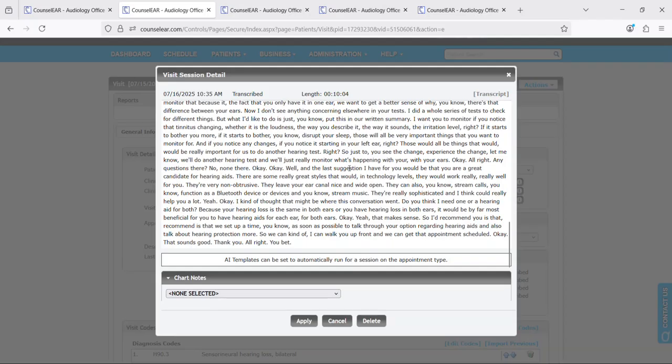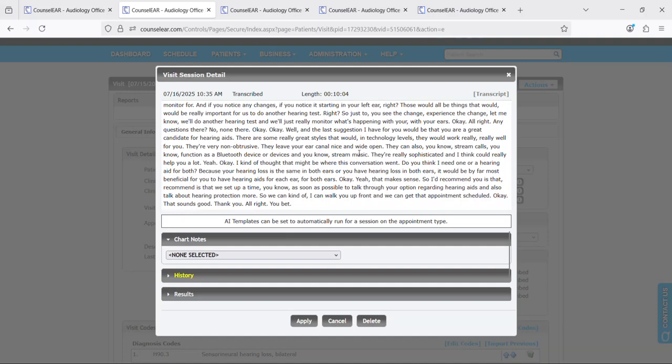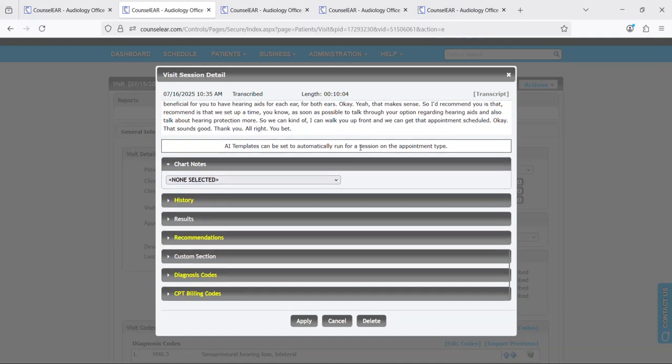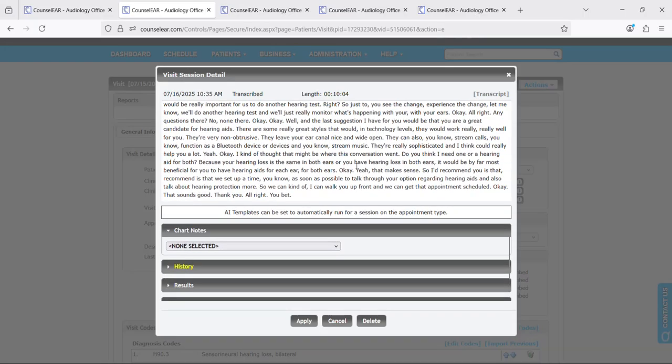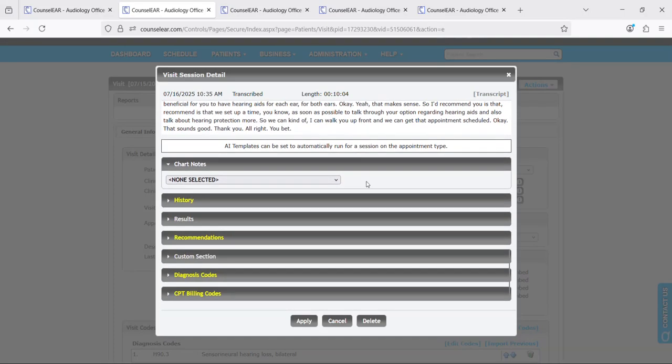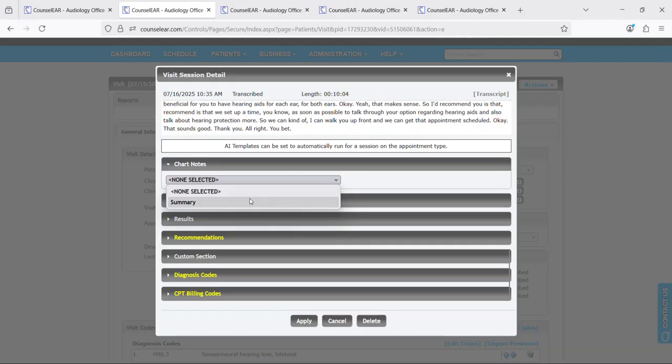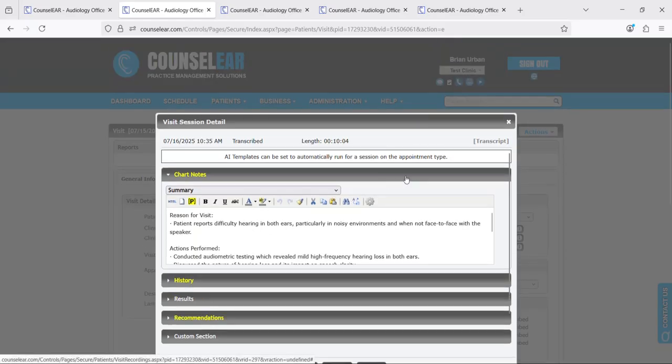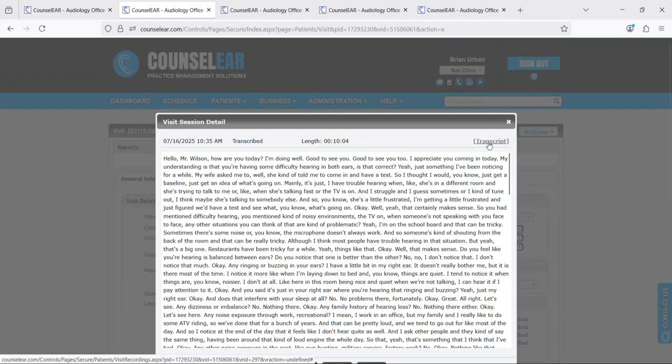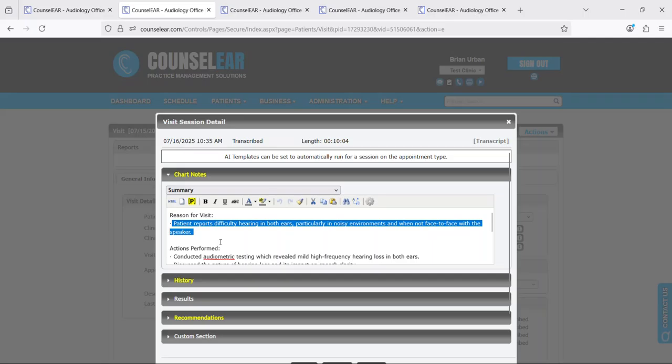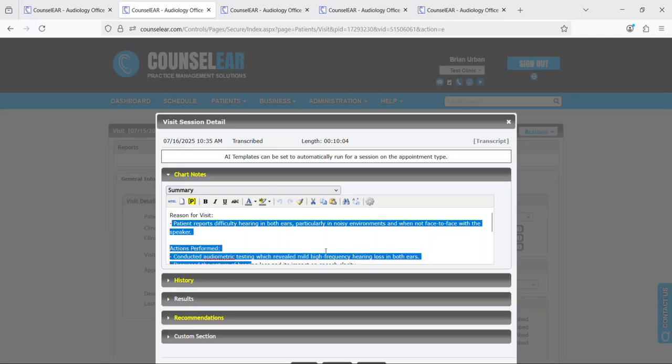You then can apply your AI templates against this. What that means is you can basically say, okay, with this transcript I want the AI system to help me summarize it. So let's do it here for a chart note. So what it did was it took the transcript that we have here, it ran it against the AI template for a chart note summary and it came back with the following text.